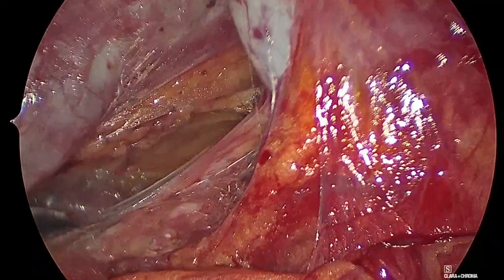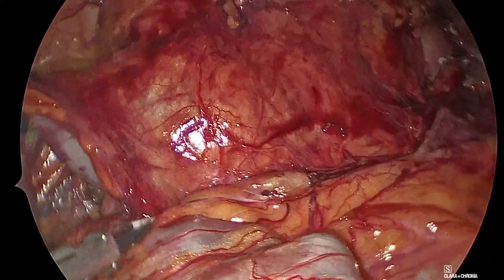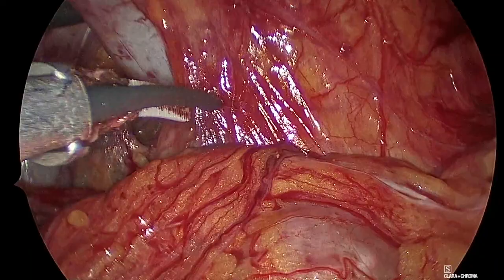Okay, so now we're going towards the psoas muscle. Psoas muscle is there. Good. Move back. Good. The gonadal vein is there. We just saw it, and I'll show it to you in a second. Let me just get rid of this.